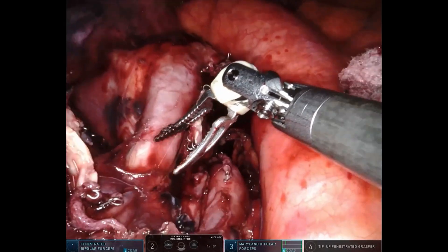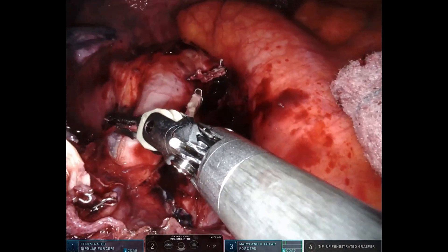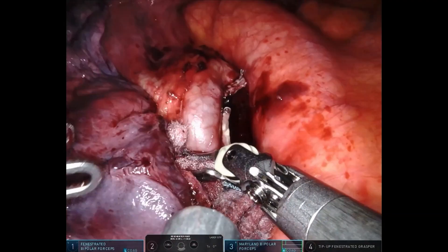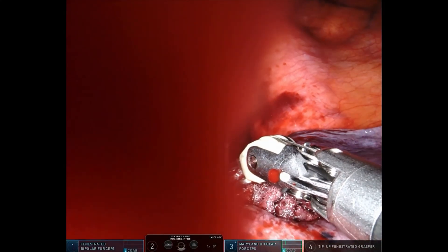We are currently performing the section of the left pulmonary artery during a robotic surgery. An injury occurs resulting in bleeding from the left pulmonary artery. Initial hemostasis is achieved through gentle compression with a dry gauze pad, but upon release, active bleeding resumes.